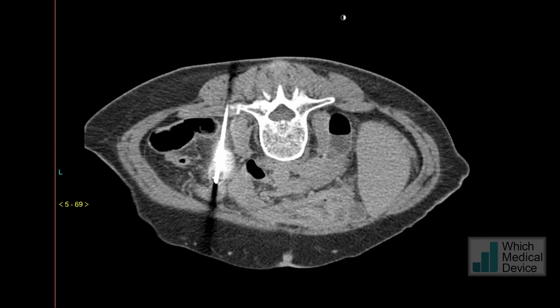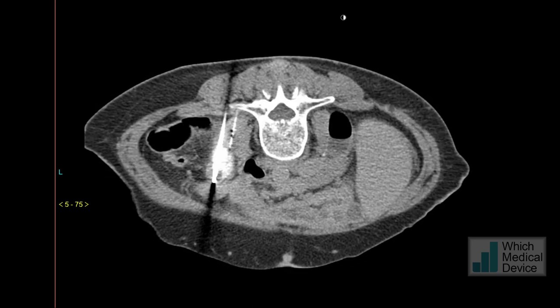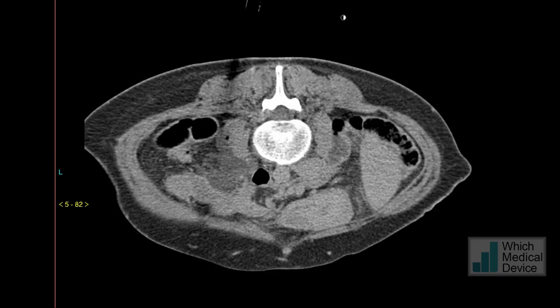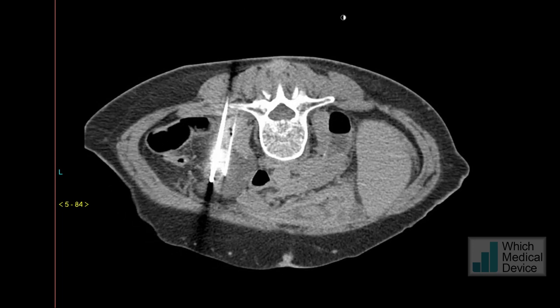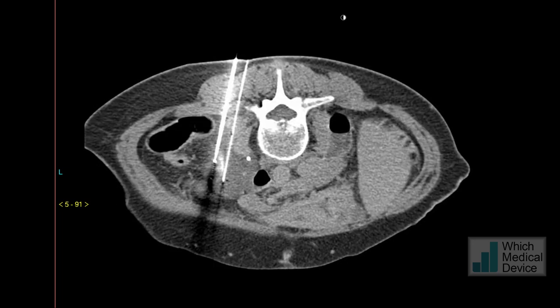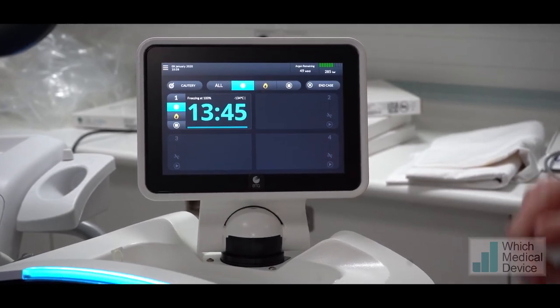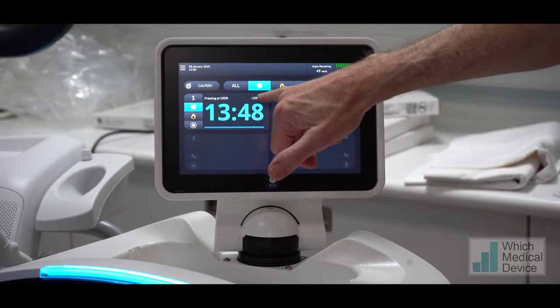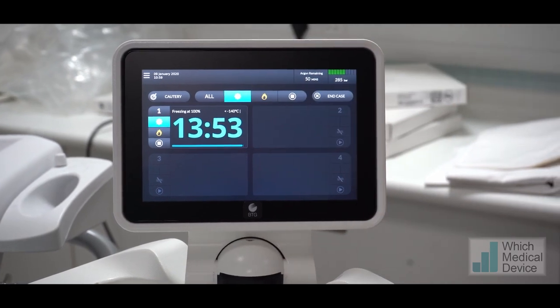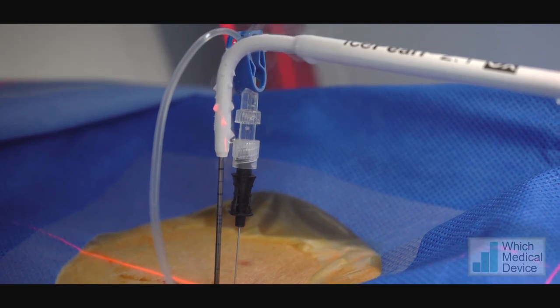We use a parallel trajectory, passing through the psoas muscles, just lateral to the ureter which on the delayed phase contains some contrast. Once that needle is in the small window and a small amount of saline is injected, it becomes a lot easier. We then press the button giving us 100% gas flow, which gives us ablation, and we perform this for about 10 minutes. The approximate temperature is minus 140 degrees at the needle tip, though of course this is just an approximation. You can see the needle in place right next to the hydrodisection needle.